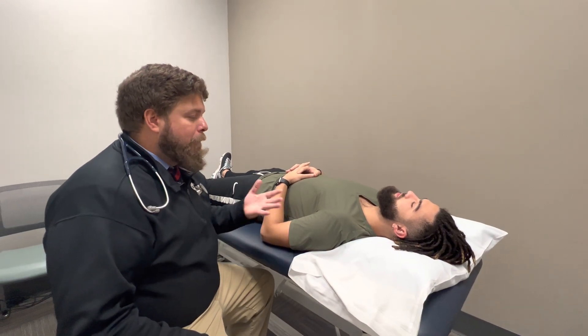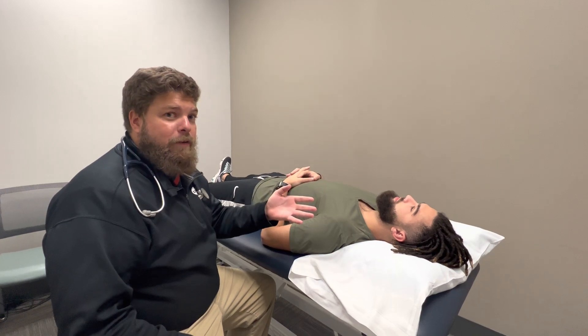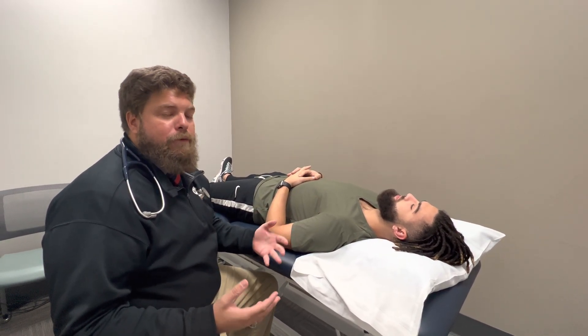Okay guys, so I'm Dr. Severin. We'll be going over carotid auscultation. Really basic skill. If you know how to palpate the carotid artery, auscultating is pretty much a cinch.